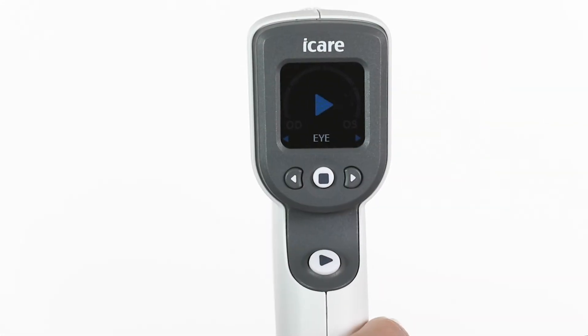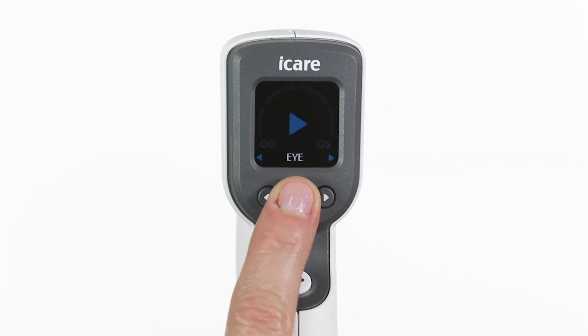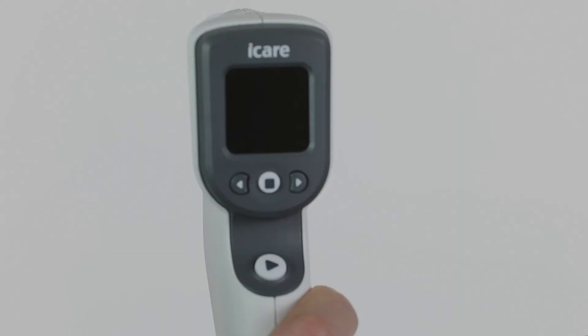When turning off the tonometer, press and hold the select button for 3 seconds, or the device will turn off automatically in 3 minutes if not used. Please refer to the manual for additional information.